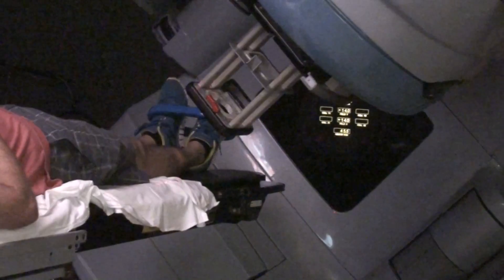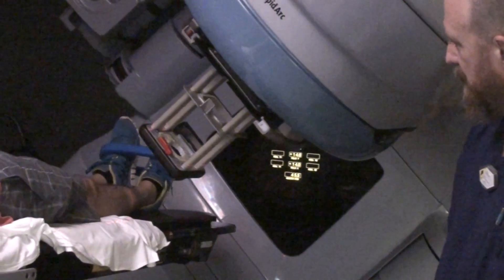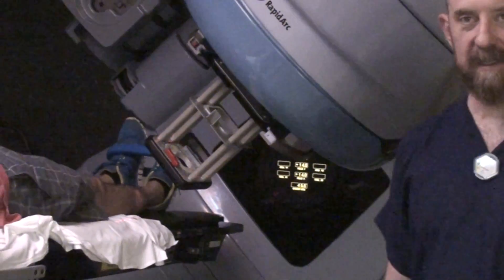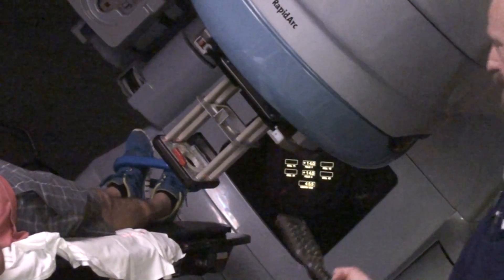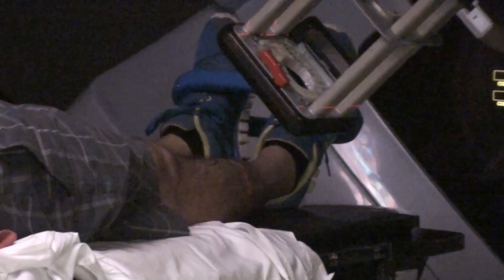In order to get closer to the machine, we can't just go up and we just can't go laterally. If we go straight up, our field is projected to the wrong place. If we go laterally to get closer to the machine, your field is once again projected to a different place.